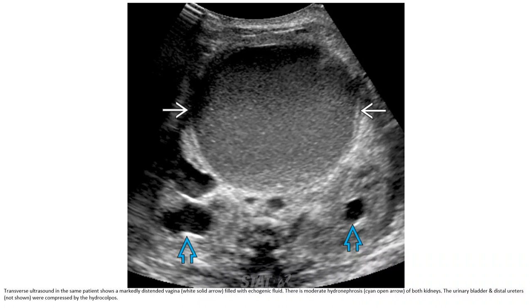Ultrasound in the same patient shows a mildly distended urinary bladder with echogenic fluid. There is moderate hydronephrosis of both kidneys. The urinary bladder and the dilated ureter were compressed by the hydrocolpos.